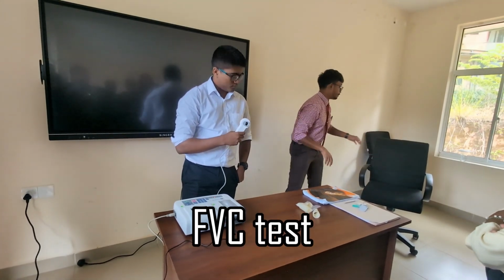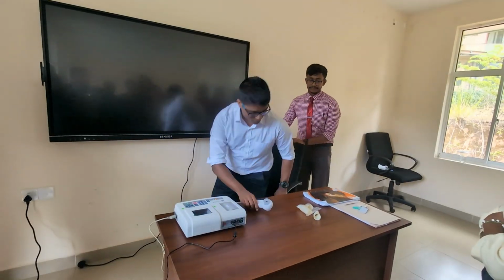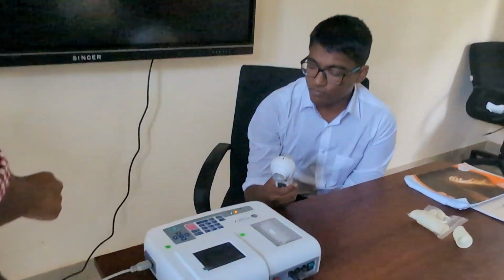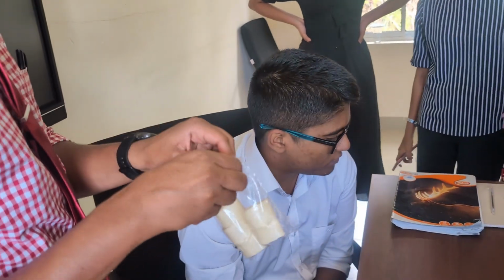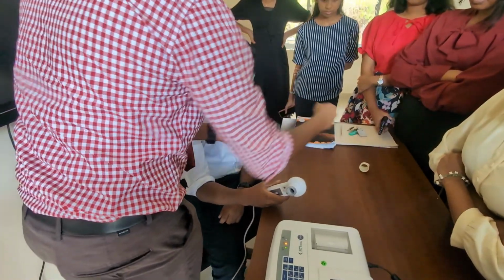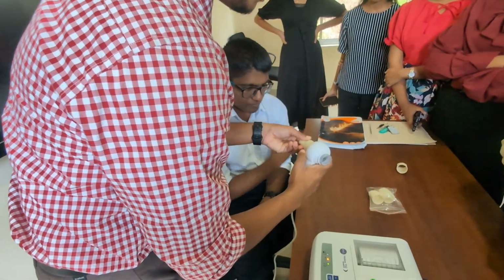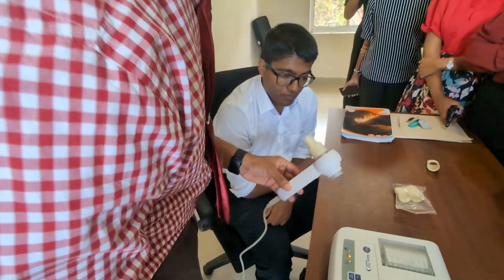So first get the patient seated, so sitting down, and then we turn on the machine. Yeah. So then we have to provide the patient with a new mouthpiece. So these are new ones, unused ones. So this is a used one. If there was a used one, you remove it and replace it with a new one. So yeah, we apply it like so. Right. So after applying, we go to the setup.